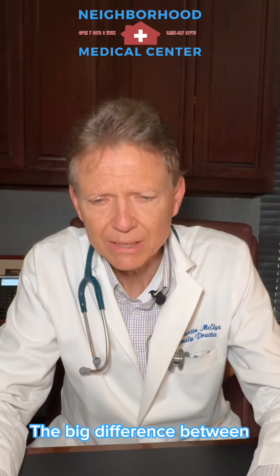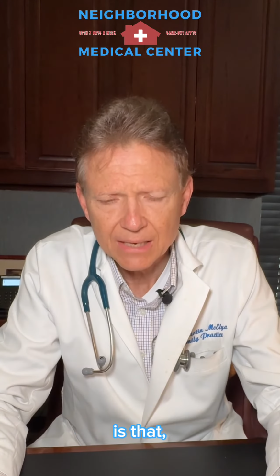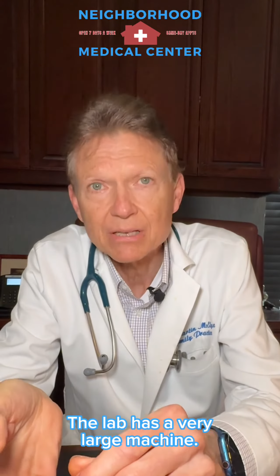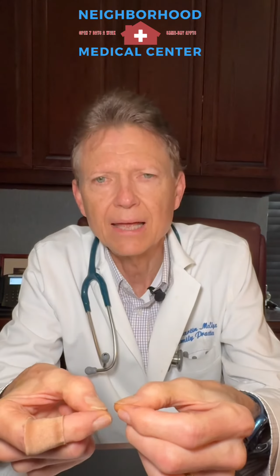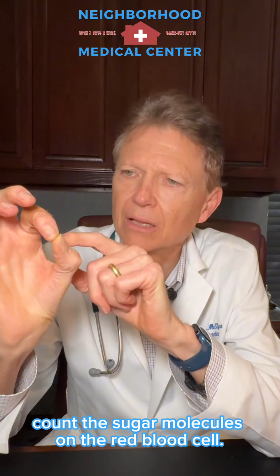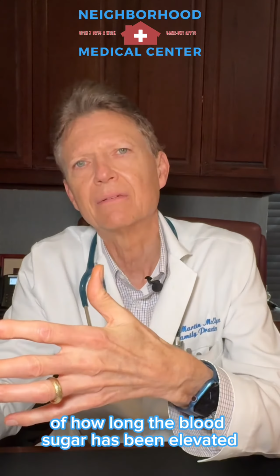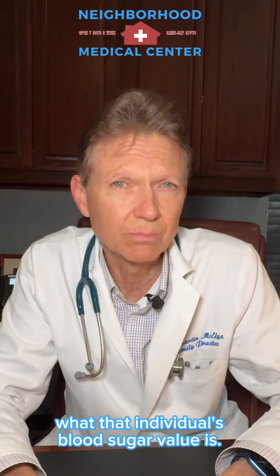The big difference between the analysis of the blood, which gives us those different values, is that a blood sugar test typically can be evaluated within a few minutes. An A1C test is sent out to the lab. The lab has a very large machine. This very large machine will take an individual's or a patient's blood in, and it will actually count the sugar molecules on the red blood cell. And by doing that, it can give you a pretty good estimate of how long the blood sugar has been elevated on that red blood cell. And from that, it can calculate approximately what that individual's blood sugar value is.